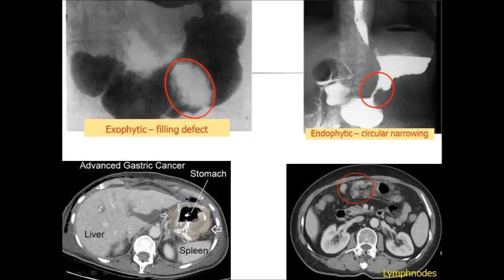On CT, primary tumor, its relation to adjacent structure, signs of invasion of adjacent structures, status of regional lymph nodes, everything may be taken from CT pictures, and everything is necessary for correct staging of the disease.